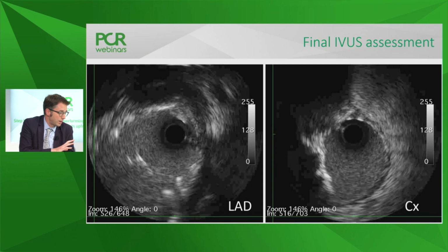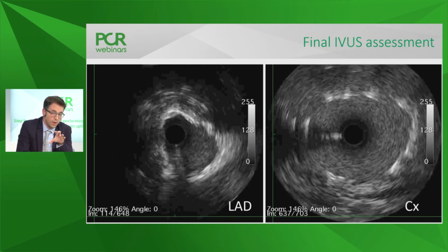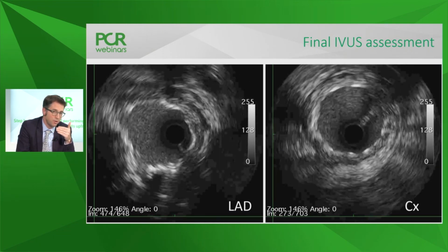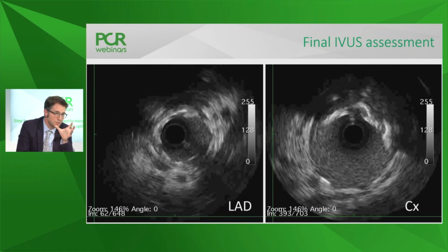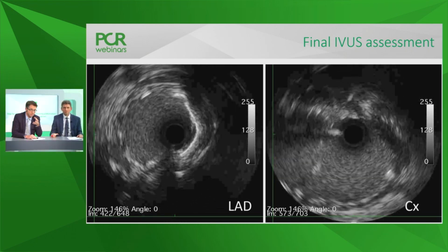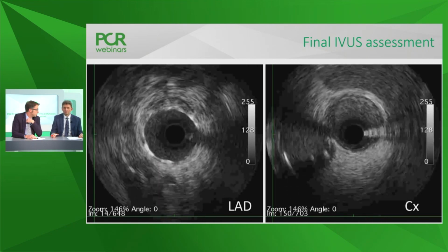The other aspect about ensuring we don't deform the stent, I'm sure some will be commenting on the fact that the stent extends back into the aorta. It's a very, very partial extension back into the aorta with some malapposition at the very top end. And clearly, a further POT here would be a very reasonable thing to consider. We haven't got that captured, but that's an important thing to consider.